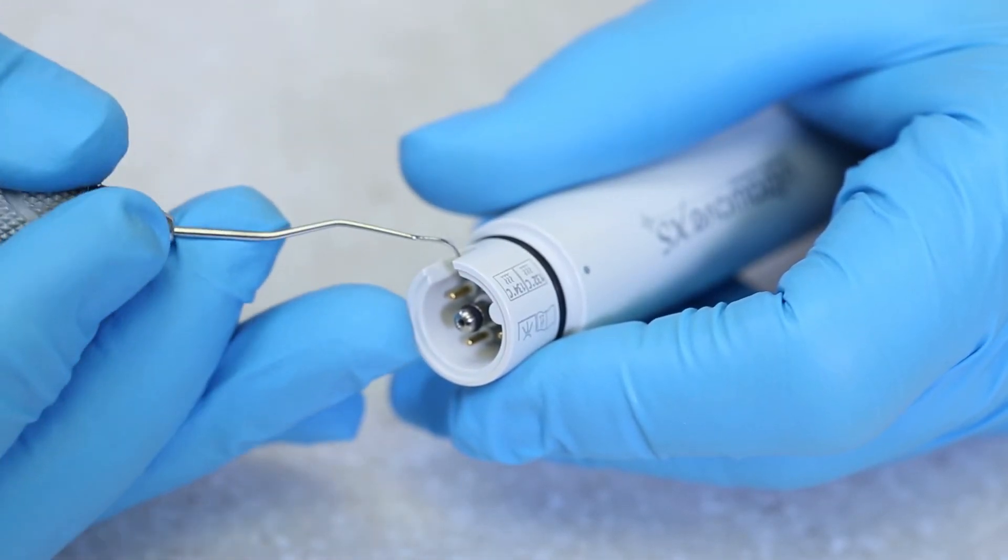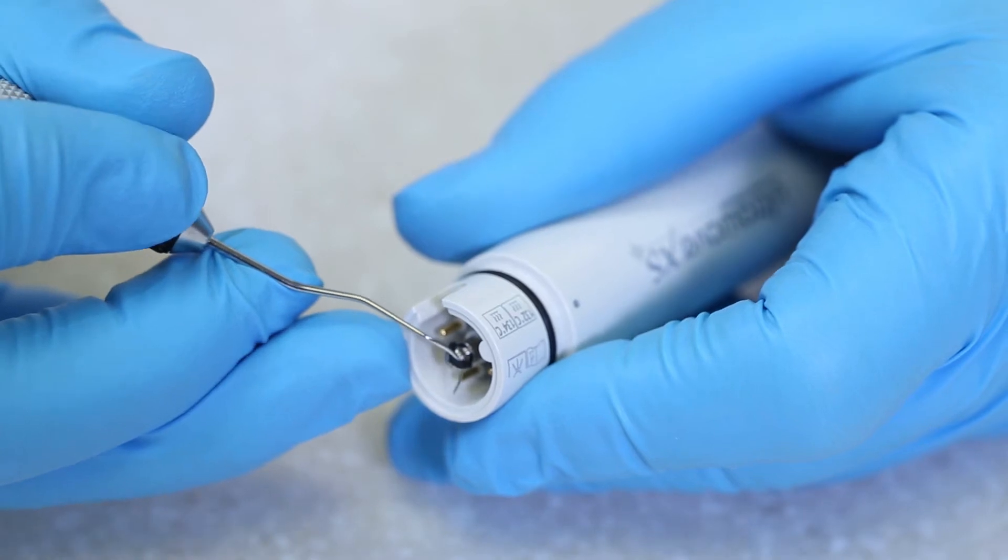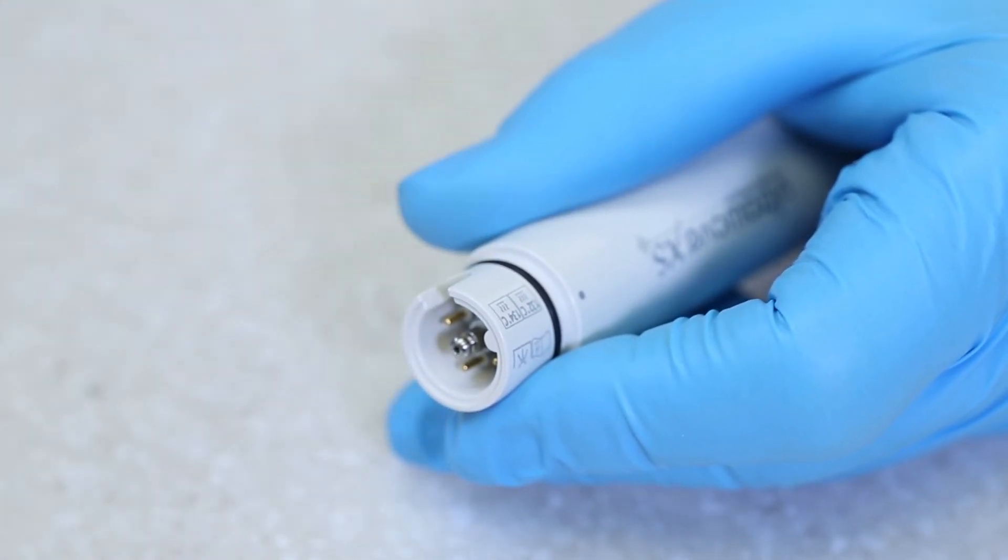Begin by removing the worn O-ring from the groove of the handpiece water connector by using an Explorer or a thin pair of pliers.